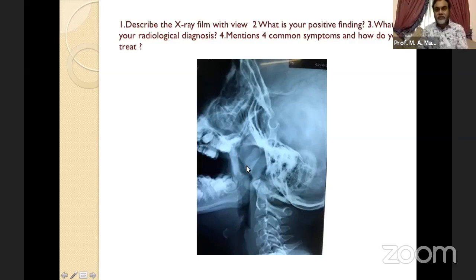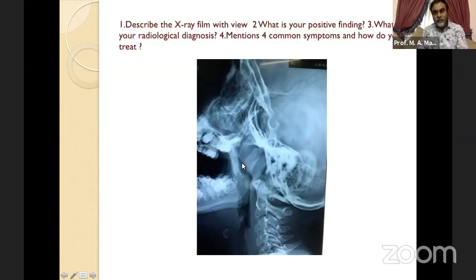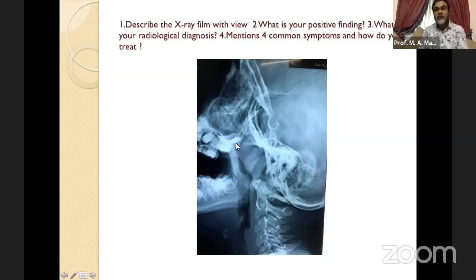Look at the nasopharyngeal airway here and the airway down from the nose. The arrow shows the normal air passage, but here a mass has completely blocked the airway. Look at this — the soft tissue shadow is touching the soft palate, nearly completely blocking the airway. So my finding is: increased soft tissue shadow in the nasopharynx obstructing the nasopharyngeal airway.